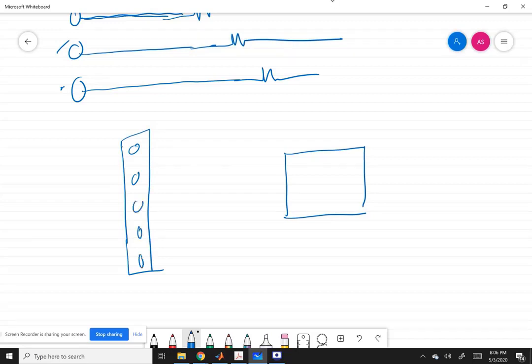Okay, so we don't know where the objects are. So what we do is we assume there is a point with some value in the space. Then we try to reconstruct the amplitude of this point. How do we reconstruct the amplitude of this point? We first find out the time of flight. If there is a point in this space, how much time will a sound wave take to go from the transducer to the object and then back from the object to each of these elements?